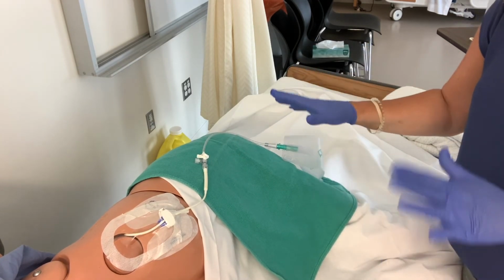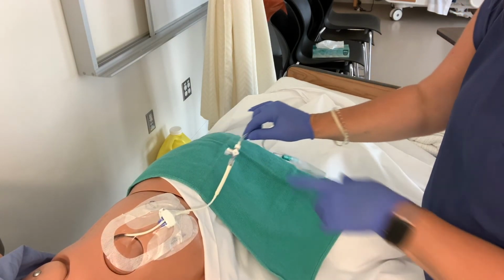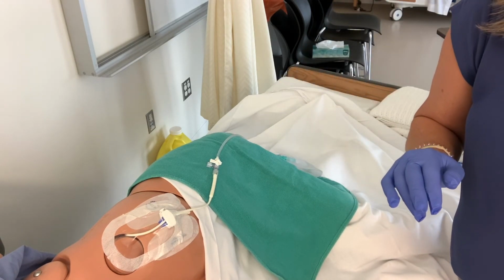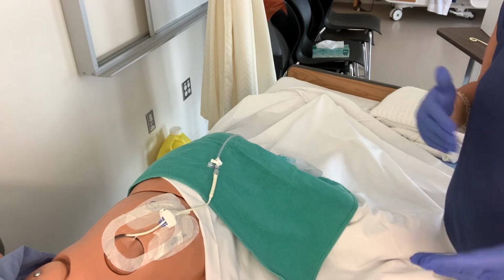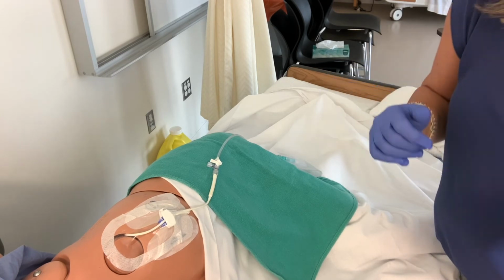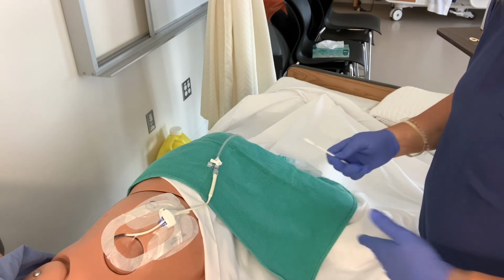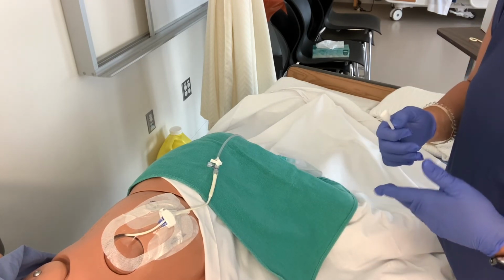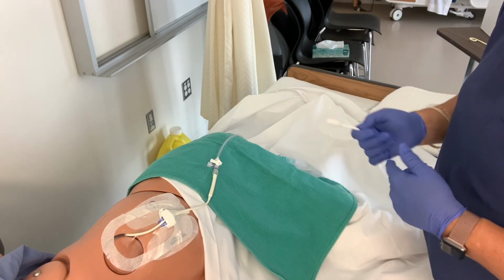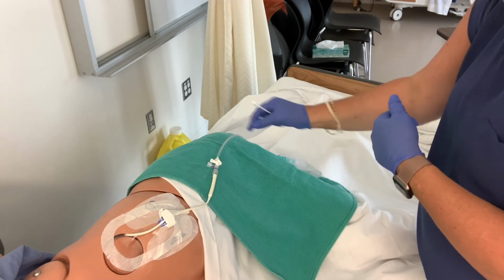So I'm going to use blue gloves, and again, we're opening the system so the patient can turn his head away. We're going to deal with the stopcock, but I don't need to use sterile gloves. Now, why? We can discuss that all day long, because we essentially are opening the system again to the patient, the same as we were doing with the flush, but this does not require sterile gloves. So for you guys starting, you might want to have a nice sterile towel to set it in. People that have better dexterity with more experience may not. There will be some variations of practice, but you just need to go slow and be sure of what you're keeping sterile. So over to the side, I would have assembled the bag and assembled the tubing.